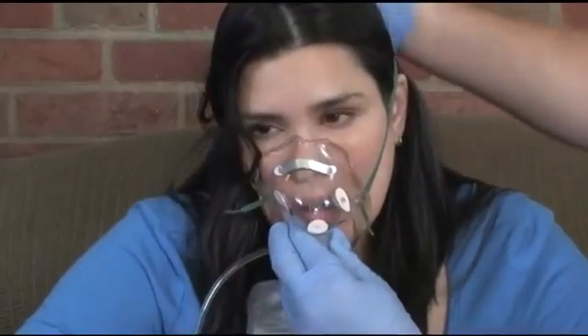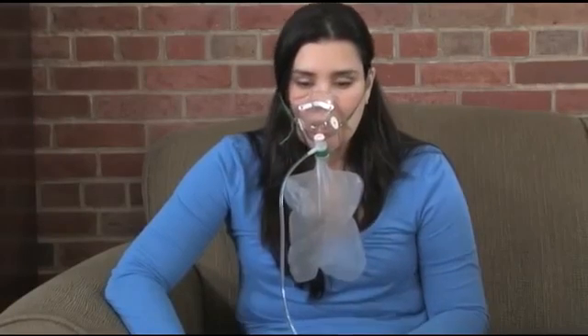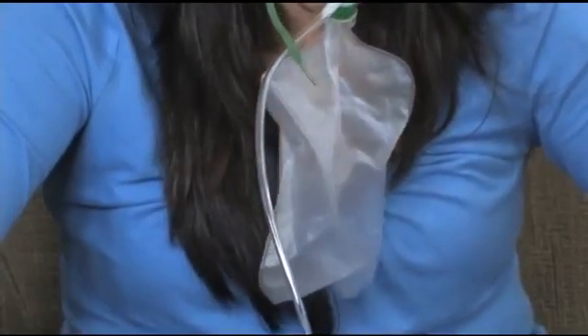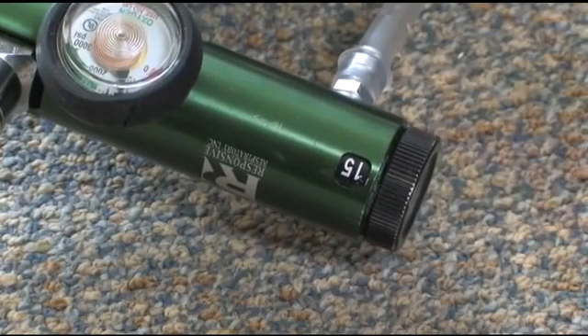Position the mask over the patient's nose and mouth. Next, slip the elastic strap over the patient's head so that it rests above the patient's ear. Tighten the strap as needed. Watch the volume in the reservoir bag when the patient inhales — the bag should be at least half full. If not, the patient is over-breathing and you will need to increase the flow rate slightly. Most regulators will allow an increase in flow up to 25 liters per minute.